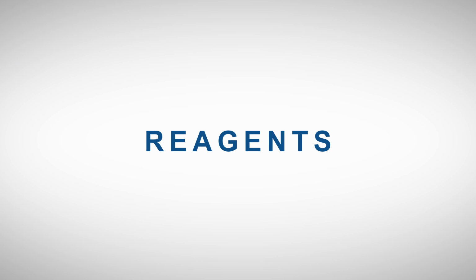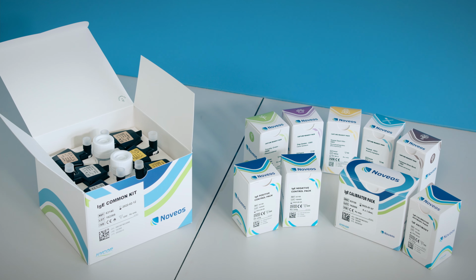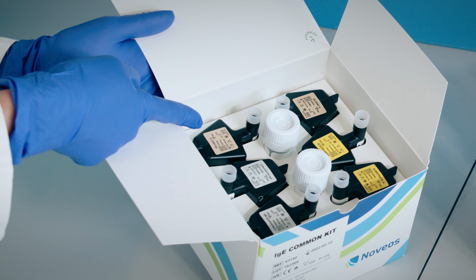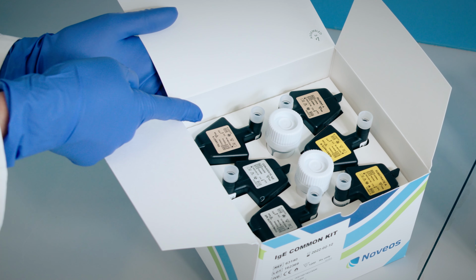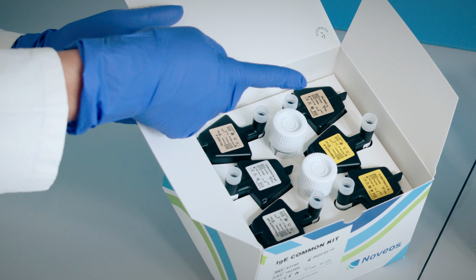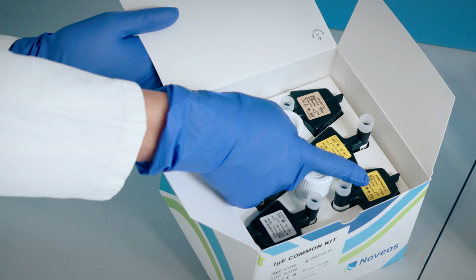Reagents. Here we see an overview of all the reagents needed. We will start with the common kit, which contains diluent A, conjugate, the fluo beads, and substrate A and B.